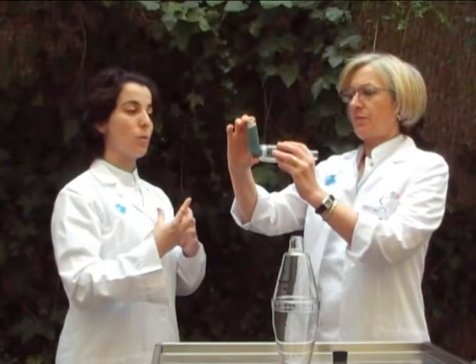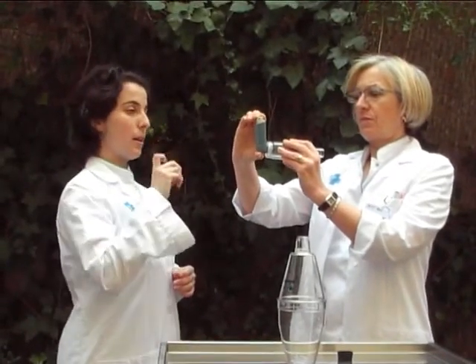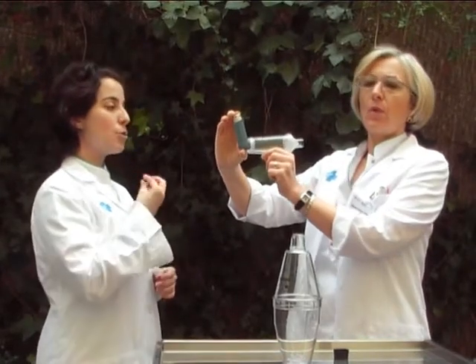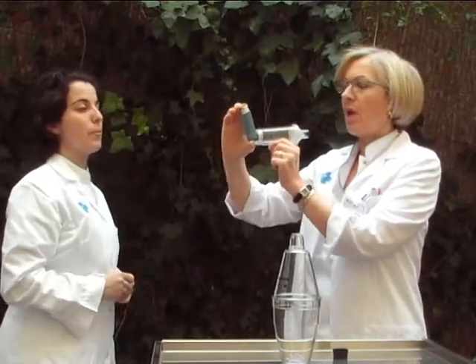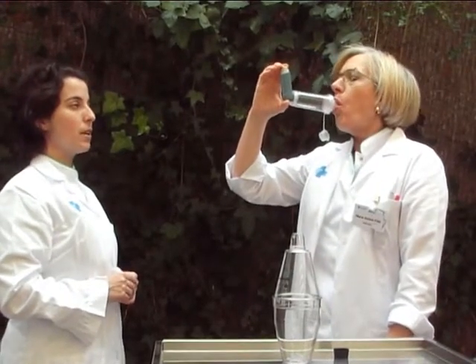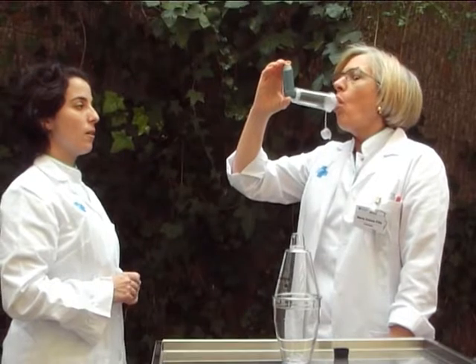If you find it hard to press the Inhaler and breathe in simultaneously, you can do it directly with the ProCember. First press the Inhaler, then adjust your lips around the ProCember and finally take in the air with a long deep breath.